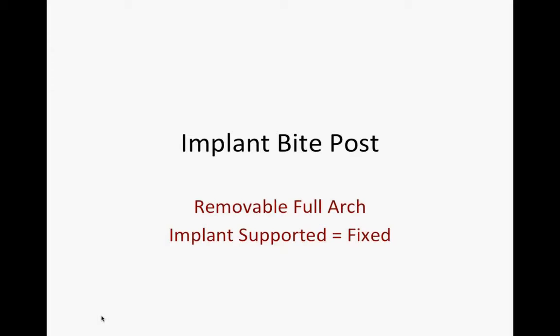So when our dentures are finished, we get another bite record. We have pre-made index casts, and then just remount the case on an articulator and fine-tune it in the lab, and then go back to the mouth and give the dentures to the patient. And we can get some really fine occlusion and virtually eliminate sore spots.